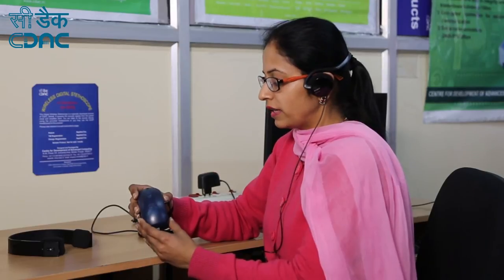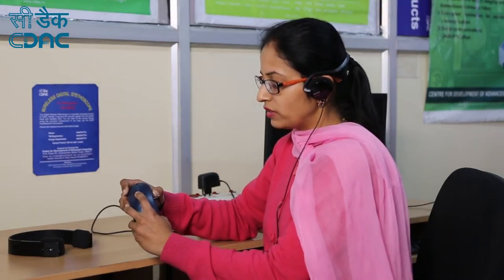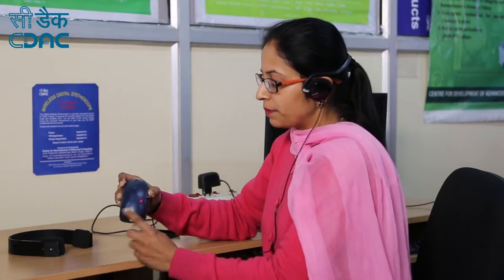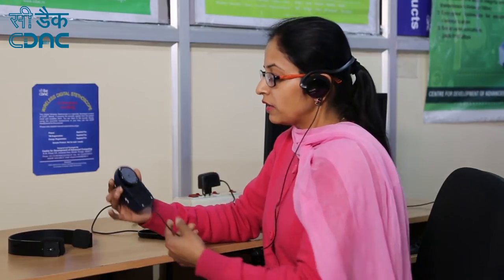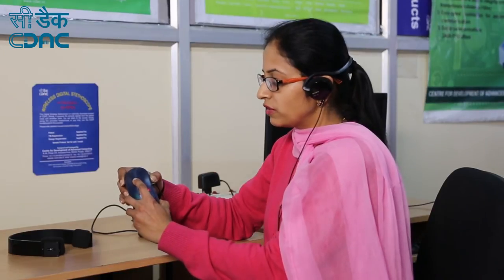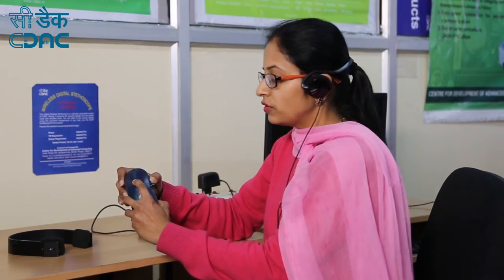To switch on the device, press and hold the switch for 3 seconds. A red LED indicates that the device is in the on state. Now place the device at the desired location to hear the audio. To switch off the device, press and hold the switch for 3 seconds.